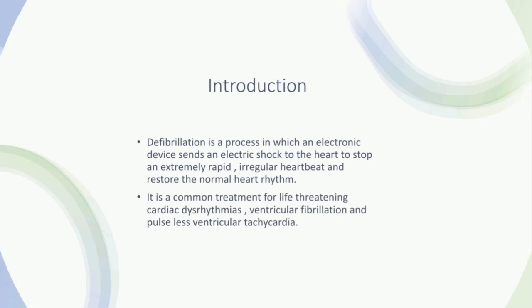Introduction. So what is a defibrillator? A defibrillator is an electronic device that uses a process called defibrillation, in which an electronic device sends an electric shock to the heart to stop an extremely rapid irregular heartbeat and restore the normal heart rhythm. The process of defibrillation is a common treatment for life-threatening cardiac dysrhythmias, ventricular fibrillation, and pulseless ventricular tachycardia.